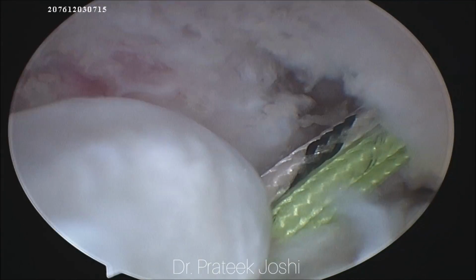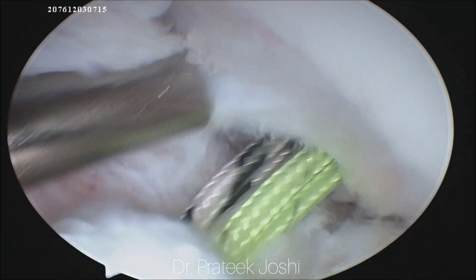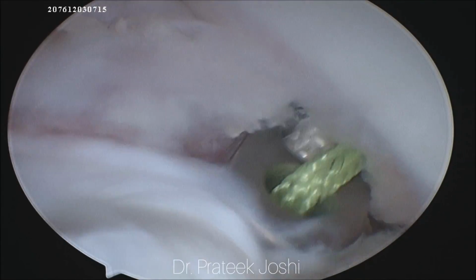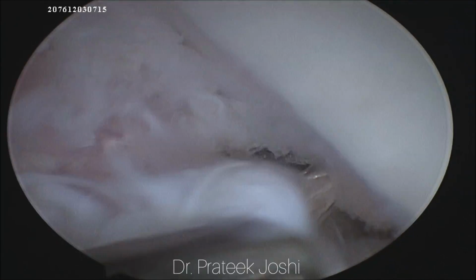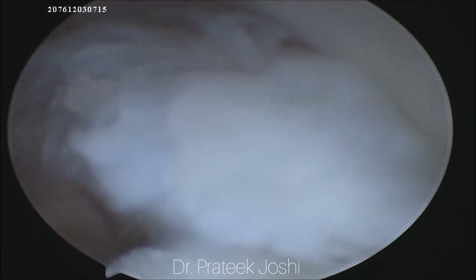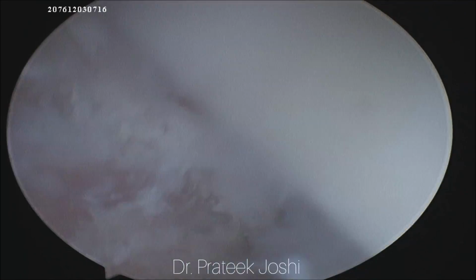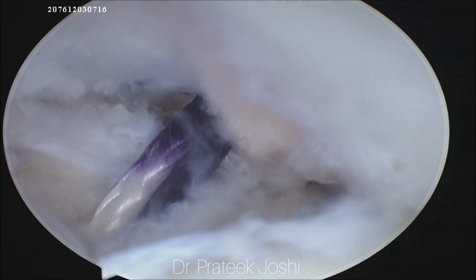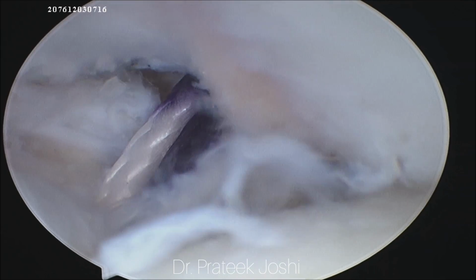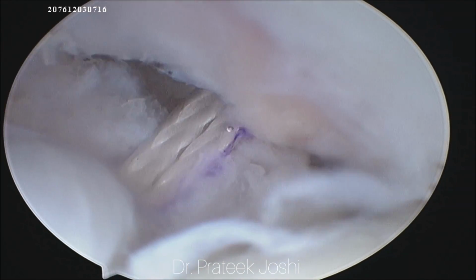So now we are passing our graft attached to the adjustable loop endo button. As you can see, I am shuttling the endo button threads from the tibial tunnel to the femoral tunnel, and as you can see, the endo button has already got inserted inside the femoral tunnel, which we are going to flip once we see the blue mark which we have made on the adjustable loop threads. This blue mark corresponds to 35 millimeter, which is the length of our femoral tunnel, and which means that the button is now ready to be flipped.